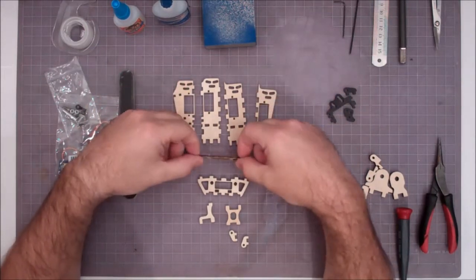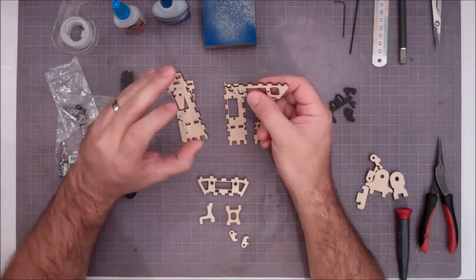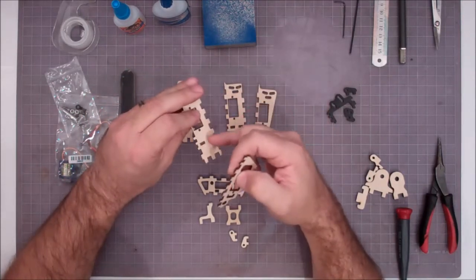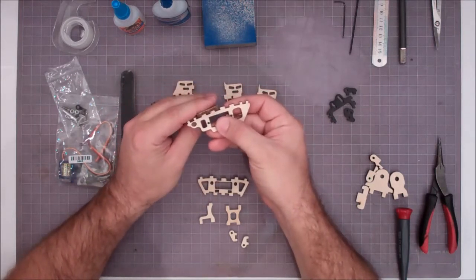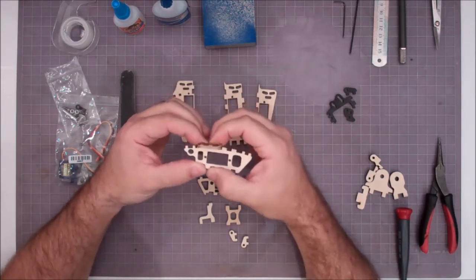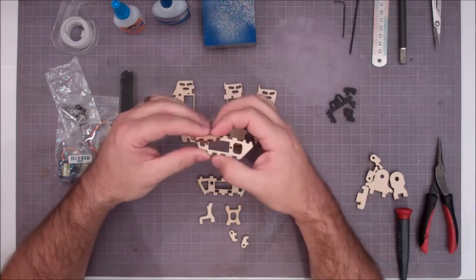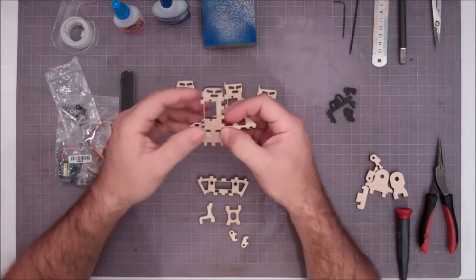Okay, so first thing I want to do is pick up your main plate, and then I usually like to start with this plate right here. It's on the center, on the thumb side. And basically, if you just look, you can see the tabs. You got 2 lugs here, and then 2 wider lugs, and you can see the 2 wider lugs right here. So basically, we're just going to key this on here. And it should just slide in. It might be a little tight. Might take a little wiggling. Take your time on these. You don't want to knock off the corners. If you do accidentally knock off the corner of one of these lugs, it's not a big deal. The part still works fine. But just take your time and you shouldn't have a problem.